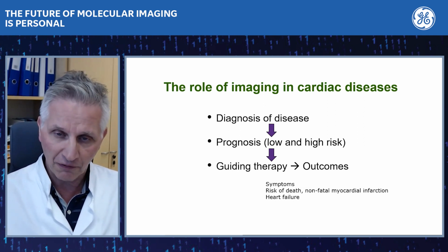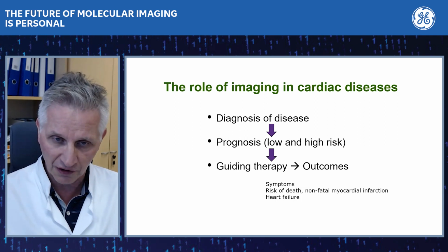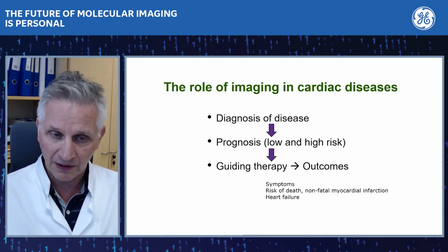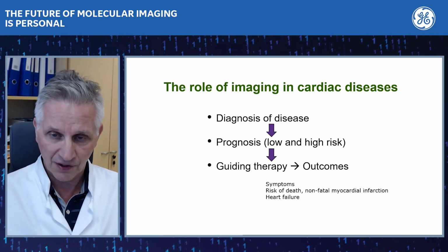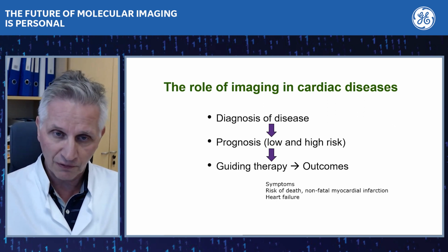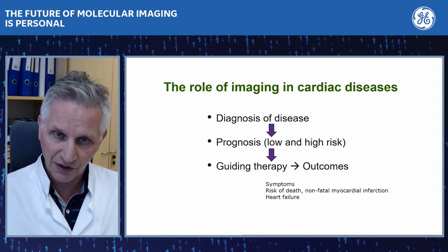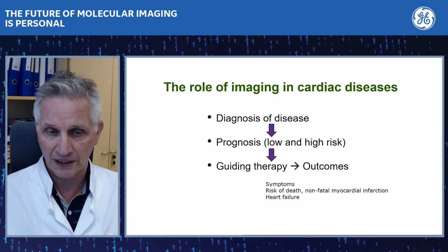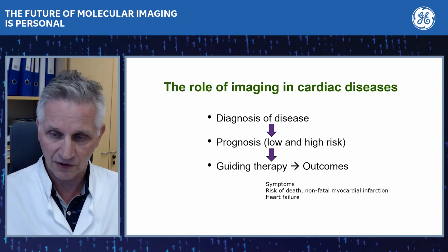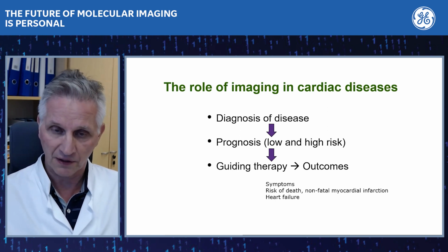And ultimately, of course, the idea would be that our diagnostics and prognosis information will have important impact in guiding the therapy decision and hopefully guiding in the way that we will improve the patient outcomes. So it's not only the detection of the disease, but information on the prognosis, and the power of the test to guide the therapy decision. And that's making really a clinical impact to our patient care.